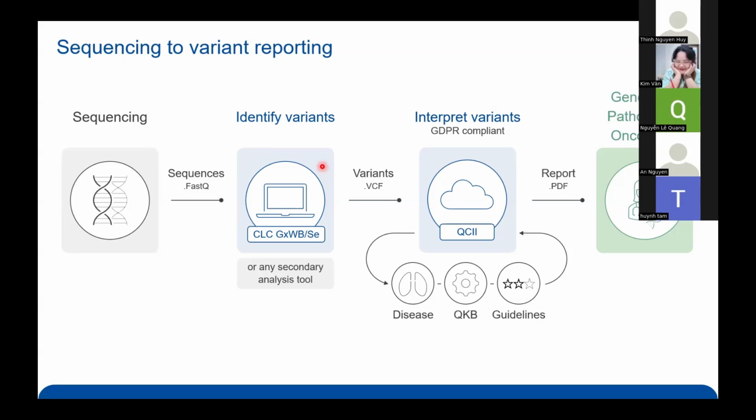So actually, there are two ways. When you upload to QCI, you can submit all the different files, or you can submit a single file if you join it outside and upload it as a single file. Or you bring individual VCF files for a single patient and you upload them as the same patient sample. So you can merge it within QCI itself. That option is also available.